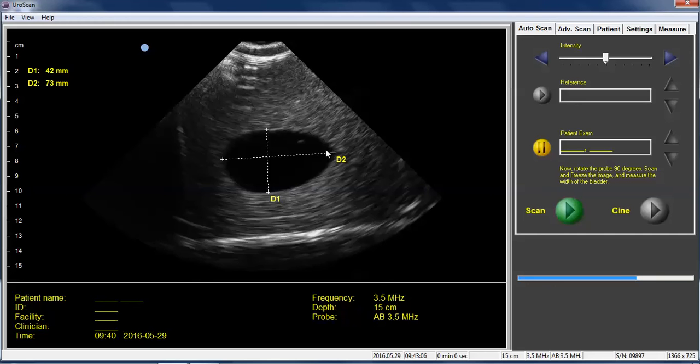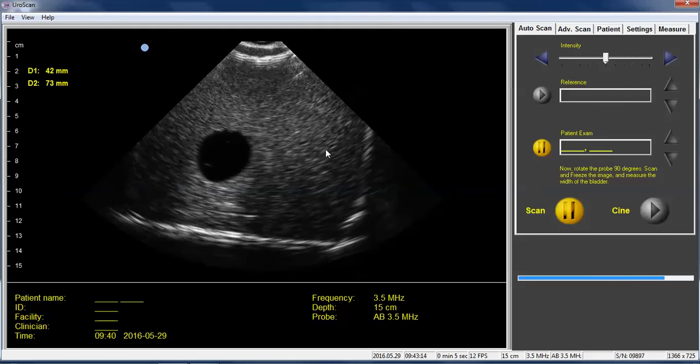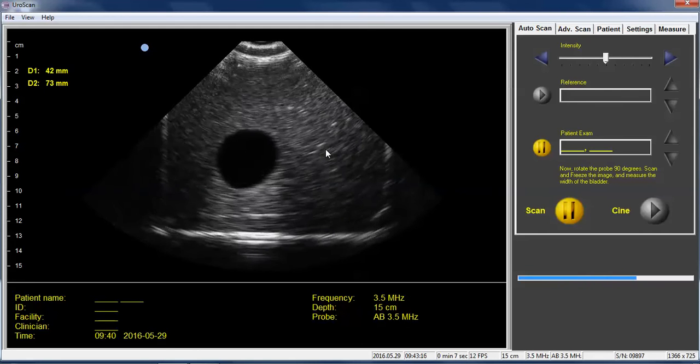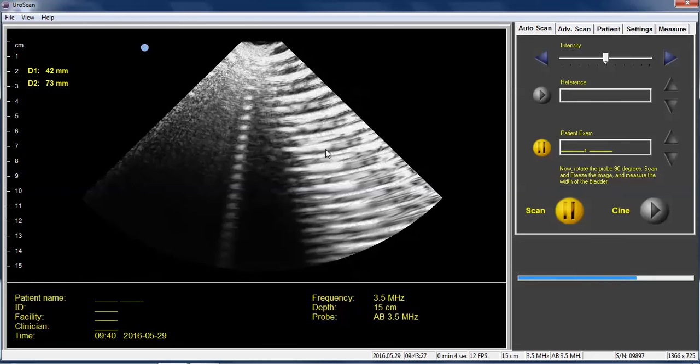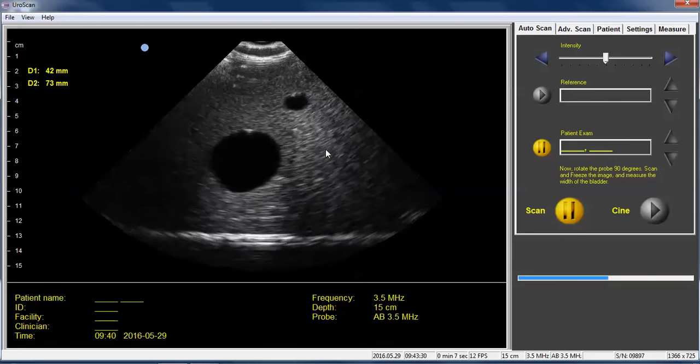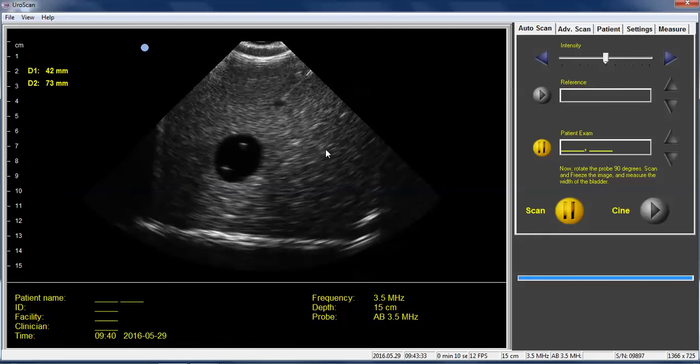So now we can rotate the probe 90 degrees, push our blue button again, and we're going to get a second image. This image looks different because we've rotated our probe 90 degrees. So if we started out with the blue button facing the patient's right or left hip, we now have that blue button facing the patient's head or the patient's feet.